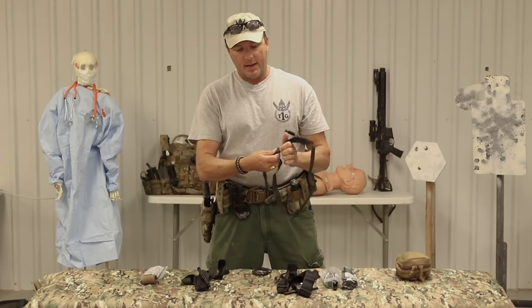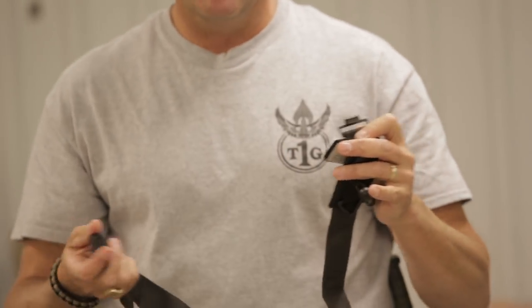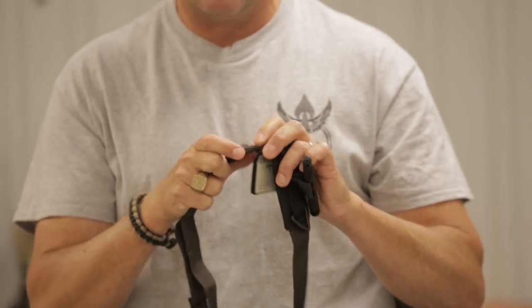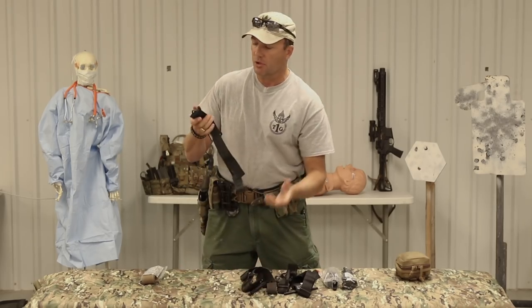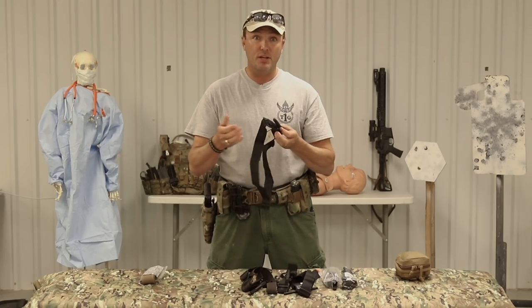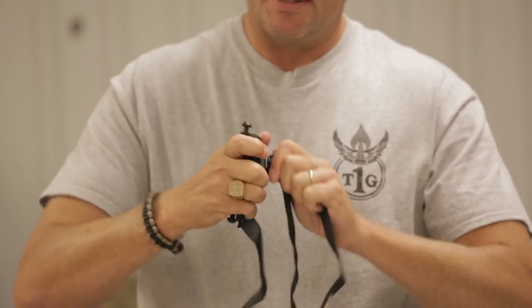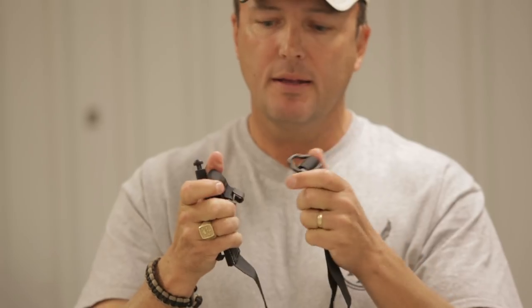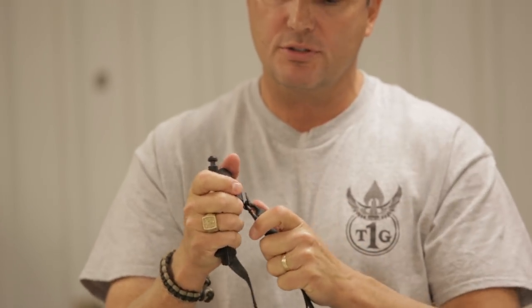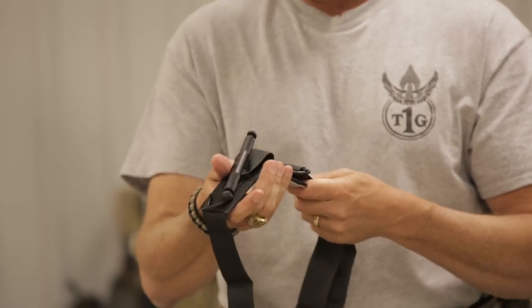However, people would complain about this buckle. The hook on the buckle would actually straighten out - the metal would pull flat if you tightened it enough. Sometimes on big bleeders with a large wound, you've got to tighten that tourniquet up a lot. On the new and improved SOF-T - the Special Operations Forces Tourniquet - they've greatly reinforced this latch. It's much thicker, heavier steel, and because of that they had to make the actual insert much heavier steel also. Very, very sturdy. You're not going to break the windlass. This is a wider tourniquet and it works great.